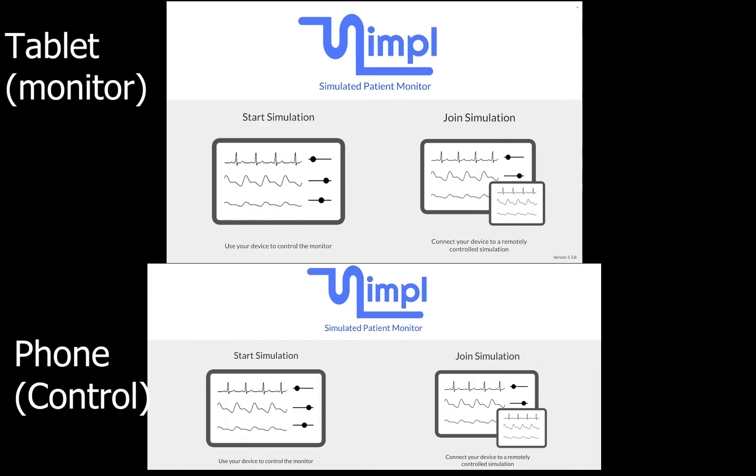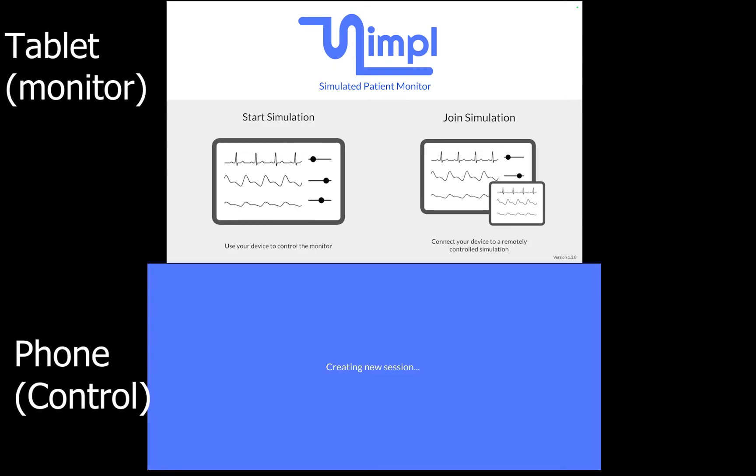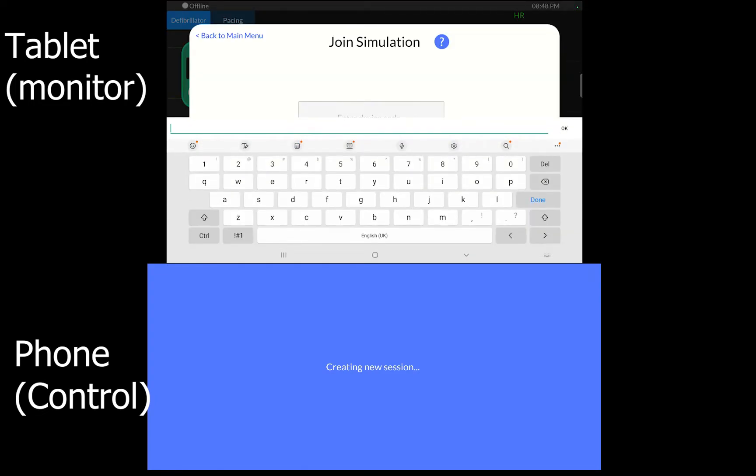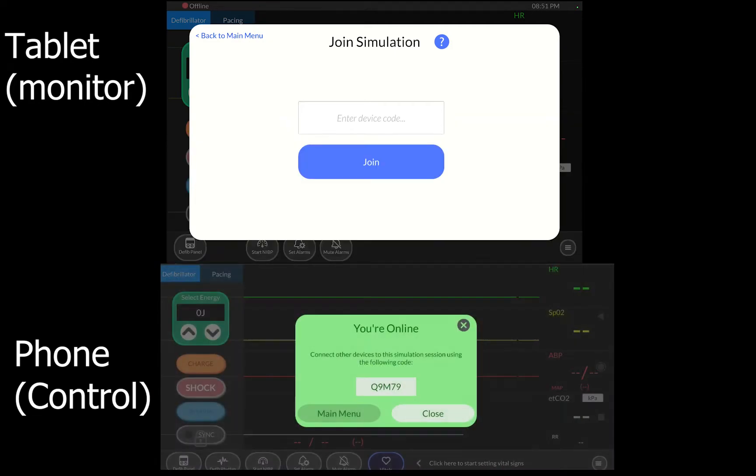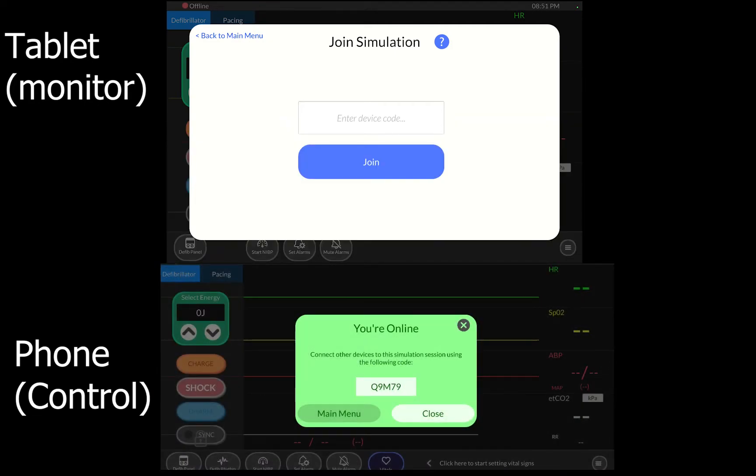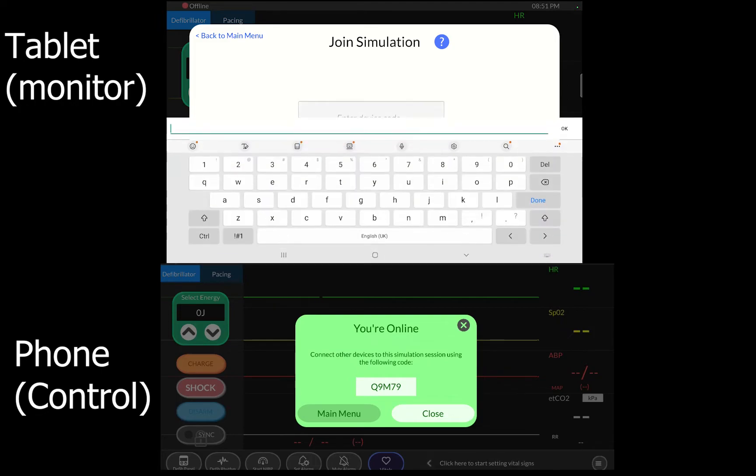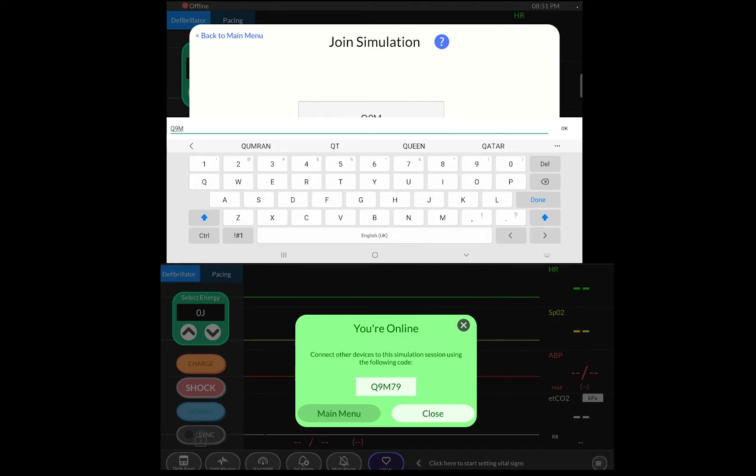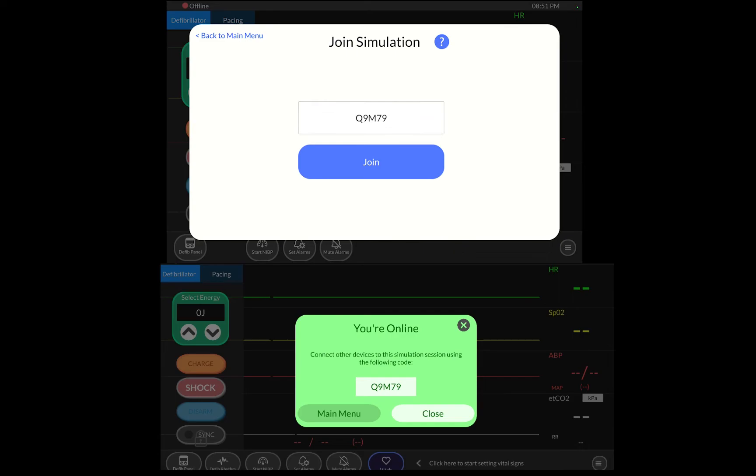On your main device or your phone, I have a phone as my main control and then I have a tablet for my screen. If I click start simulator on my phone and join simulator on my tablet, it asks me to put in a number. This number is given to me from my phone so it knows which phone to listen to. Now on my phone it's telling me that I'm online and gives me a little code. So that code I'm going to put into the tablet which is Q9M and I say join.